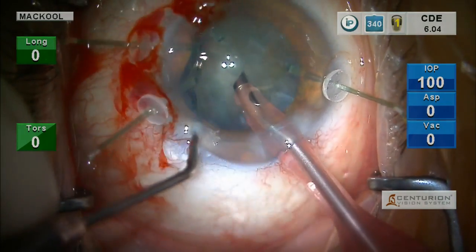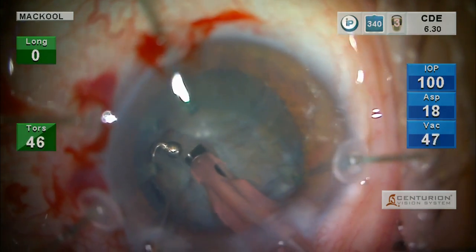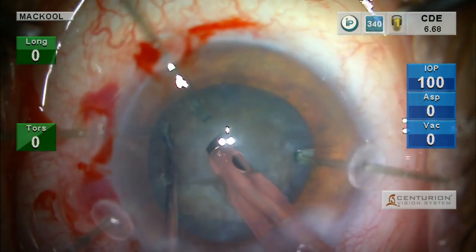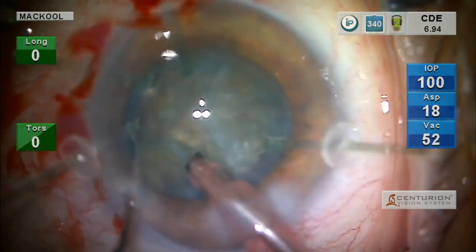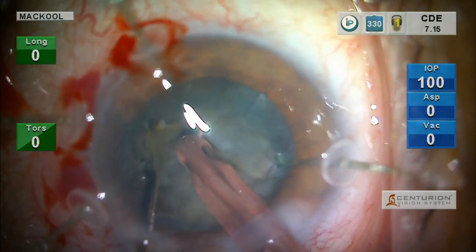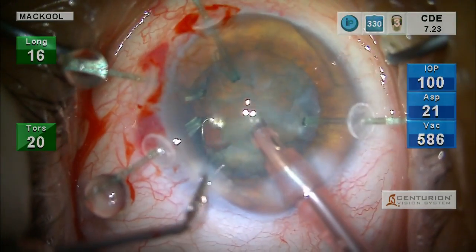It's generally easy to rotate the nucleus — we'll see if that holds true here. Let me sculpt a little more in the center. With the retractors in place, it's generally easier to rotate a nucleus because the retractors hold that capsule steady. With the capsule held steady, and working very far down in the eye, you can rotate the nucleus. Let's proceed to quadrant removal.